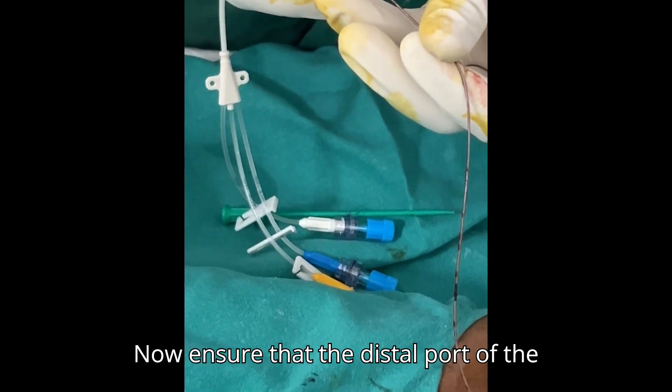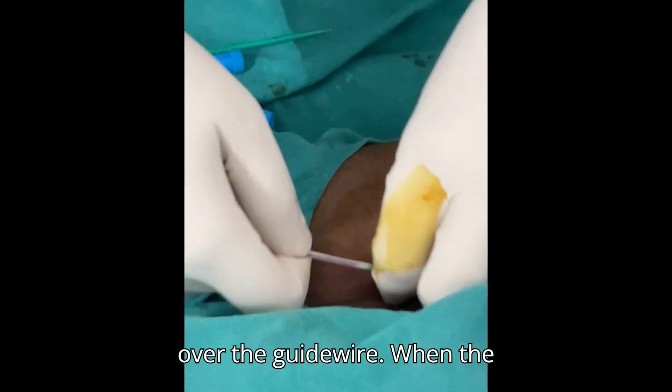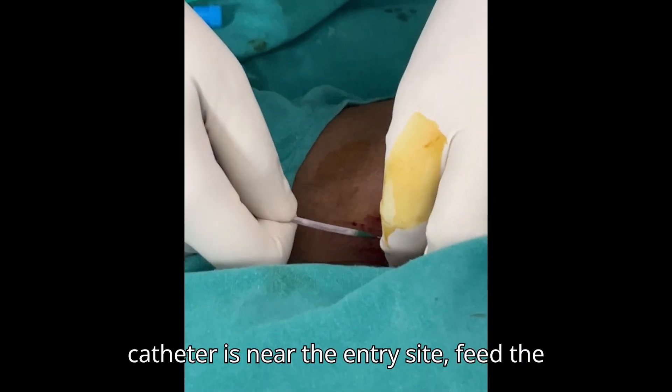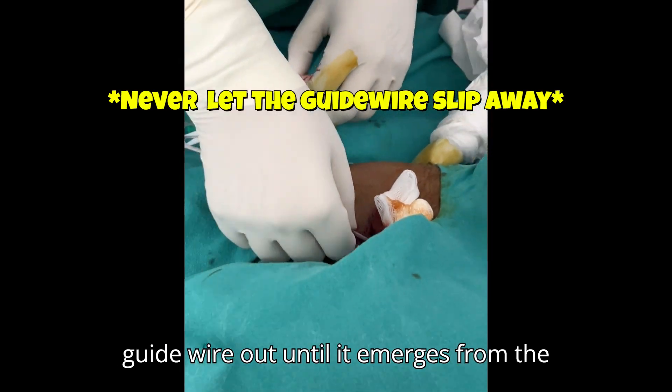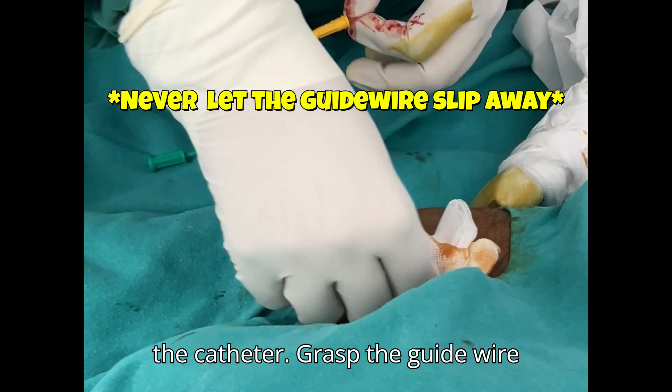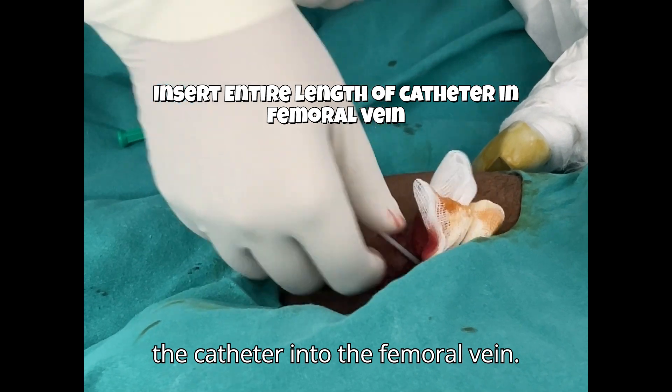Ensure that the distal port of the catheter is open and pass the catheter over the guide wire. When the catheter is near the entry site, feed the guide wire out until it emerges from the distal port of the catheter. Then advance the guide wire distally and insert the entire length of the catheter into the femoral vein.